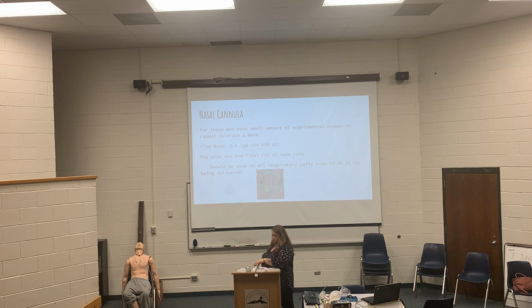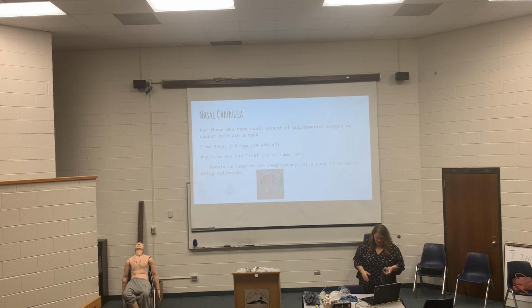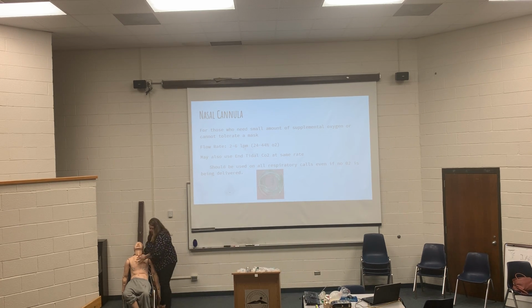But so this CO2 nasal cannula. Does anybody remember what the magic numbers are for CO2? 35 to 45. 35 to 45, good. So you can get a baseline. What you do when you first get to them, let's say the man is short of breath, inevitably they're tripoded over. He's breathing, so if he's wearing his home oxygen, you can switch it over and keep it at the rate that he always keeps it at.